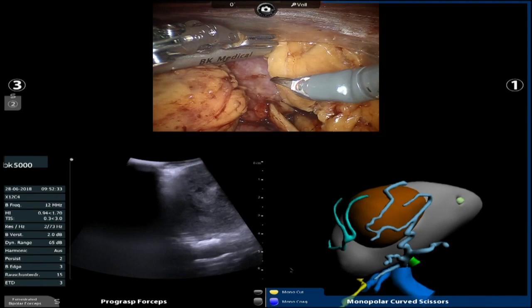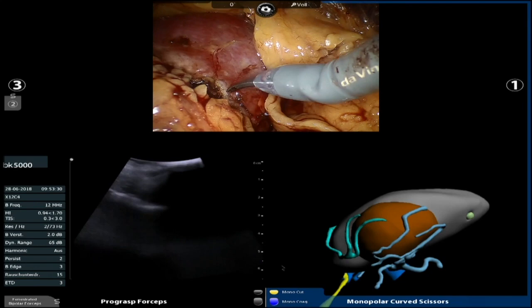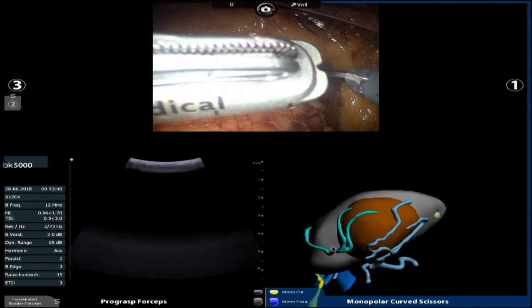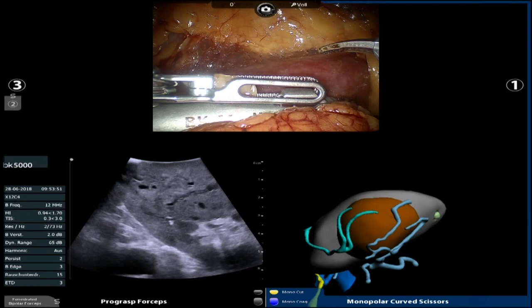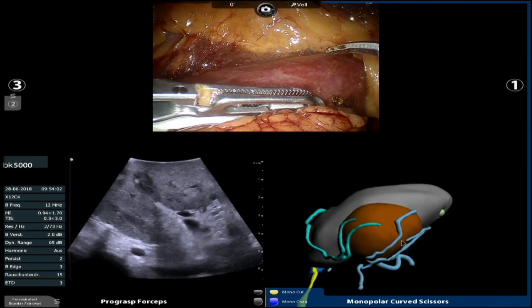Okay, so now I'm going to work on the top. Yeah, venting, good. Okay, good. Tumor, lots of tumor. I'm looking at the base, and this ultrasound quality is so good. A lot of vessels at the base.